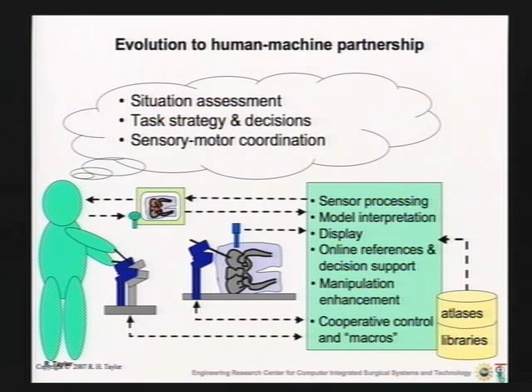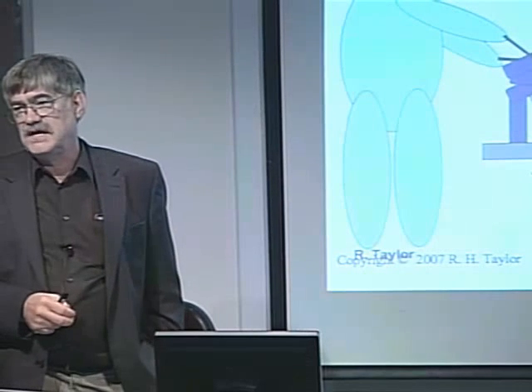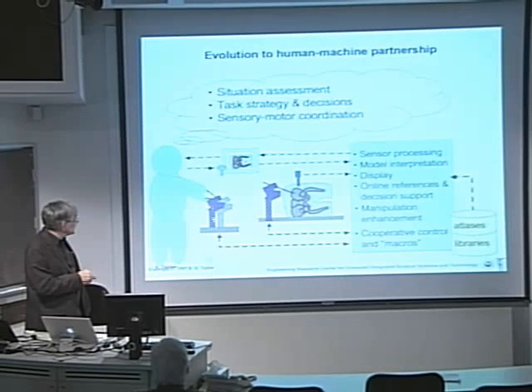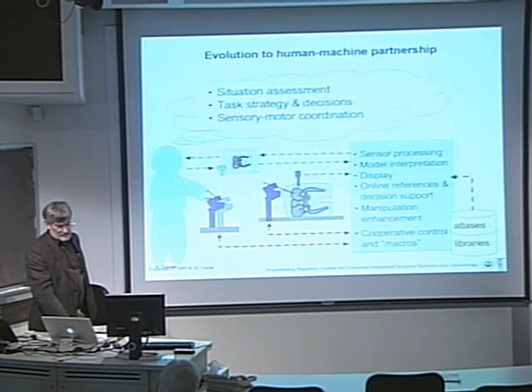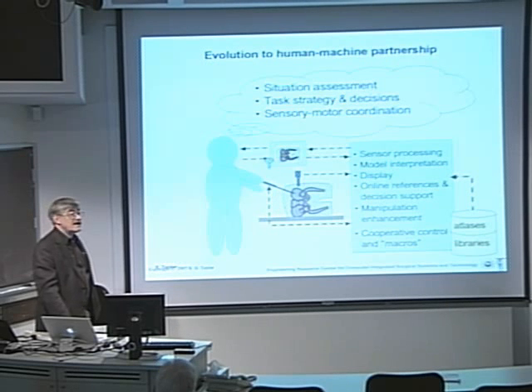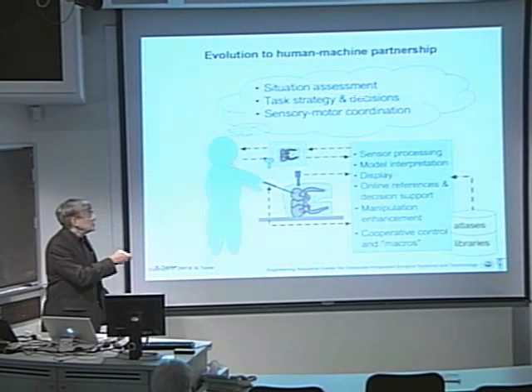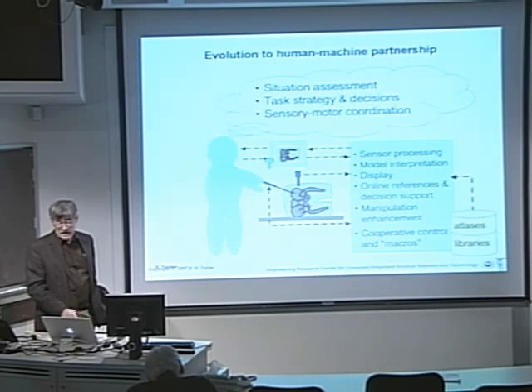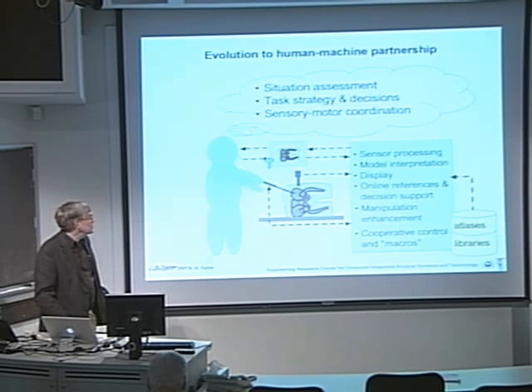Now, one of the things I'd like to emphasize is I've shown a bunch of gadgets, but ultimately the gadgets give you some capability, but it is the information that lets you use the capability. And what we've really done is, for instance, in this telerobotic case, we've put a computer with a lot of information between the surgeon's hands and the surgical instrument. Whether you're doing teleoperation or hand-over-hand operation or this active tremor cancellation, it does matter, but not a great deal. There is still a very large part of these systems, and the underlying problem is basically the same. This is one of the motivations we had for building this modular open source environment, where I'm expecting by September we'll want lots of collaborators to work with us on it.